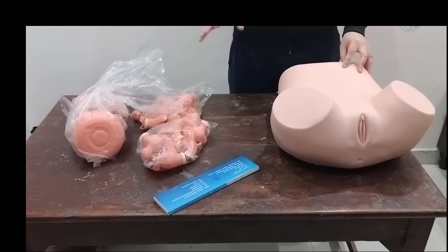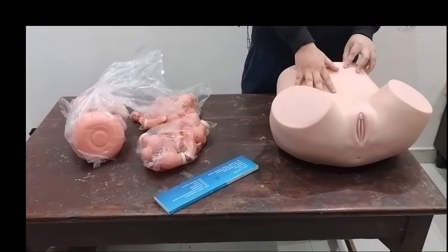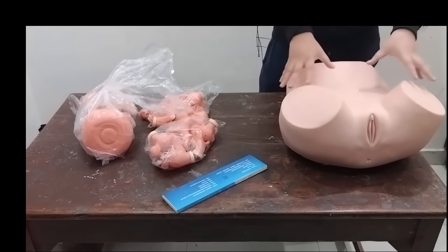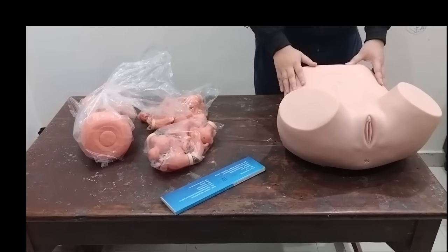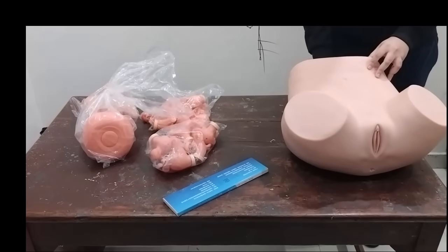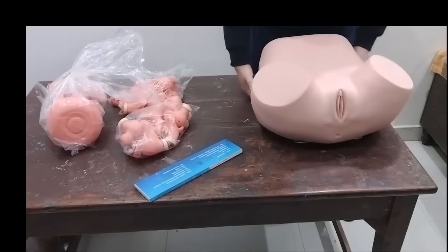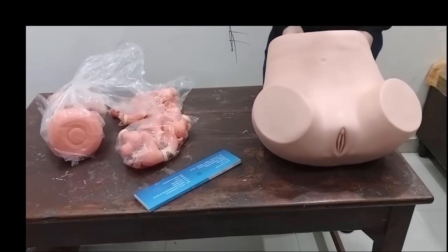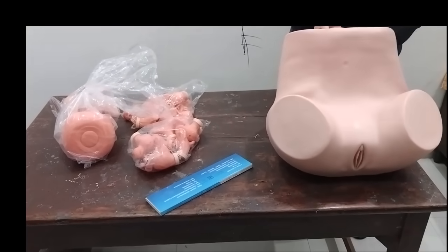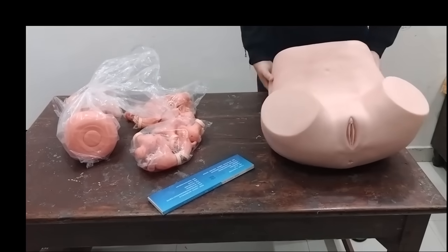So if we want to change the uterus that comes attached with the model, we first need to remove this outer skin. It is quite simple — you just pull the velcro. Be gentle while you pull it off.